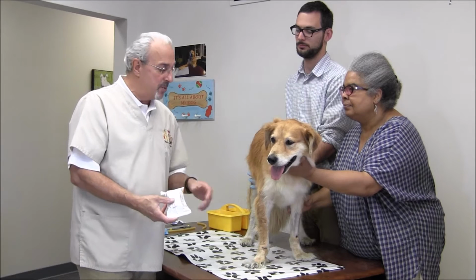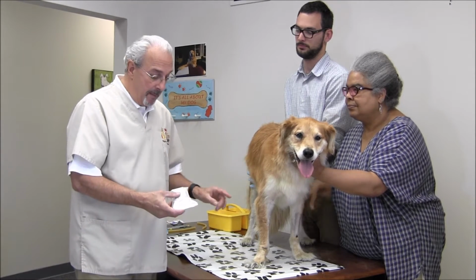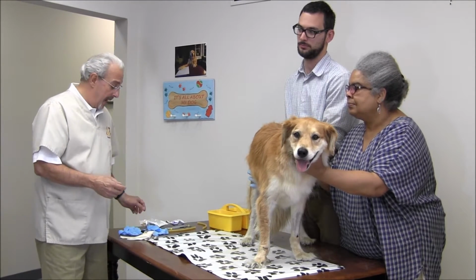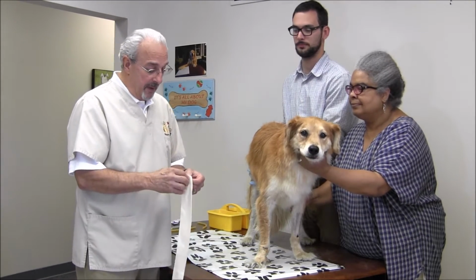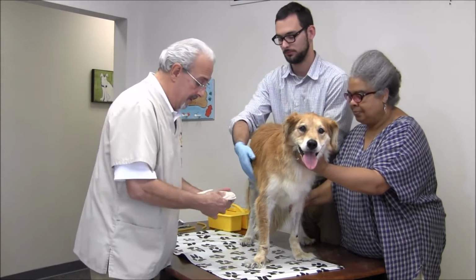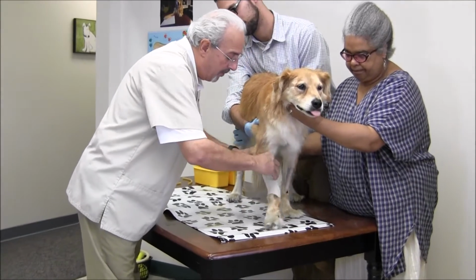For small dogs, we generally use either 1 or 2 inch casting tape. But for larger dogs, we use 2-inch casting tape and sometimes even 3-inch casting tape. So let's go ahead and get started. And we're going to just put on some stockinette. And the stockinette is going to just gently come up over the paw.